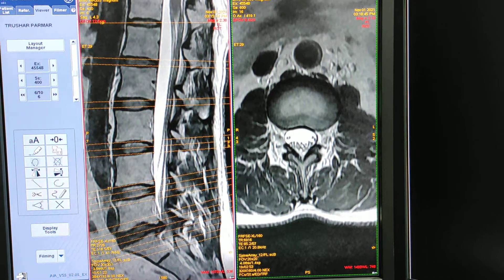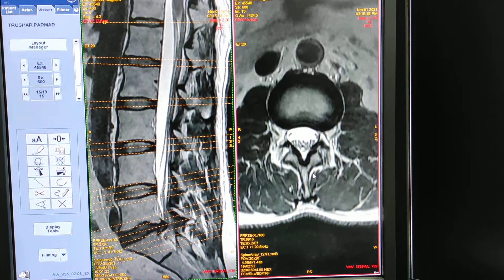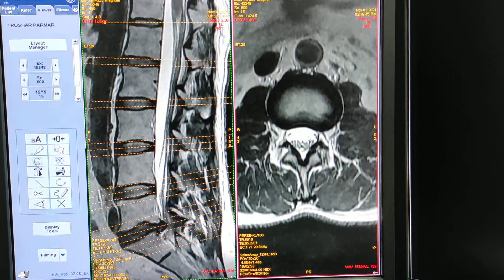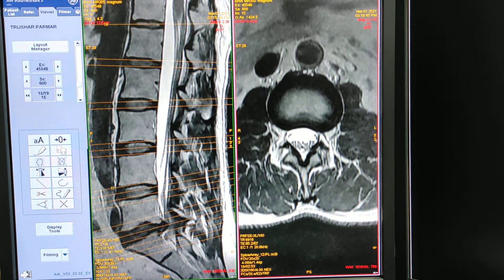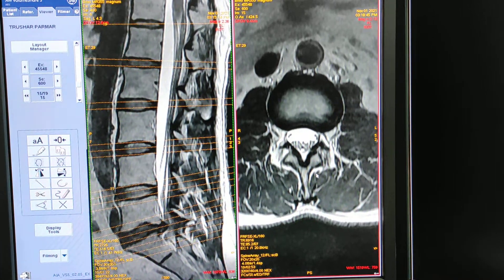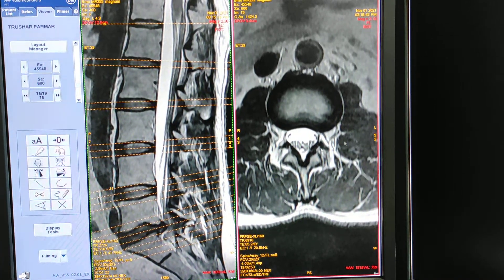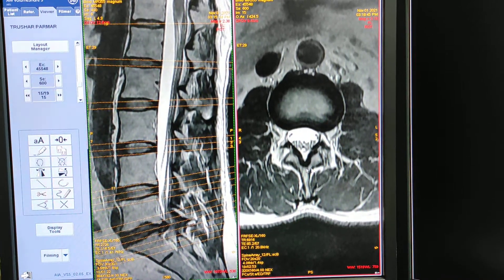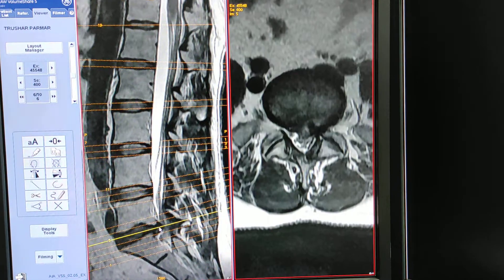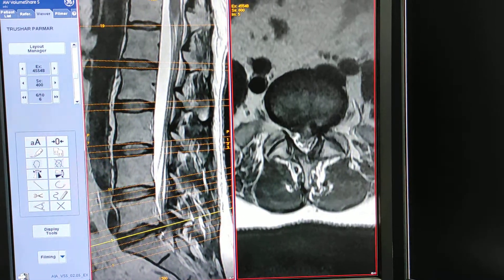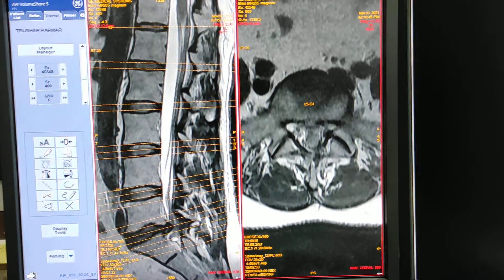This is a normal view of a disc — there is no herniation, bulge, annular tear, or anything else. Now we will move on to the L5-S1 level.